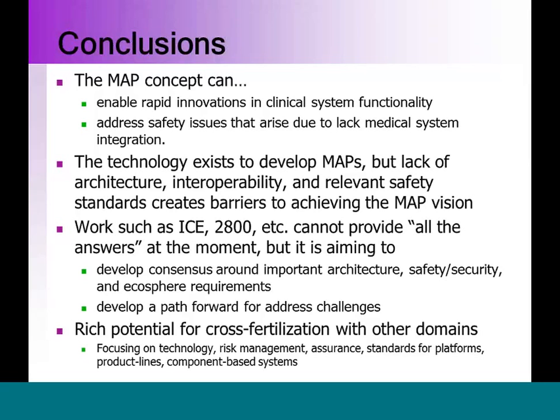Yeah. So again, there are various ways these systems could be deployed, and it depends on the level of criticality that you want to support, obviously. The main partitioning guarantees that we've developed as part of this would allow you to, for example, run these devices in isolation, but still be on the same network as the hospital traffic.